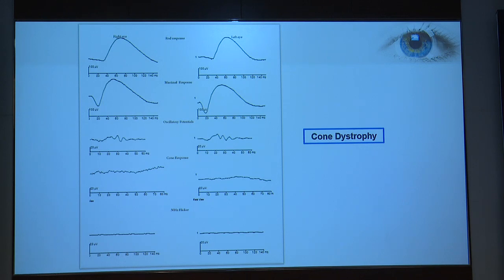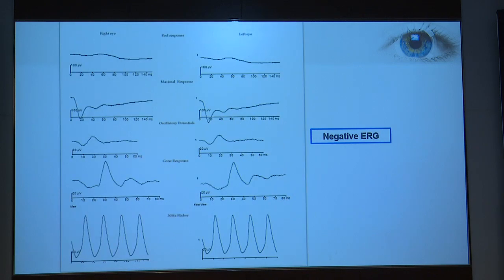We can talk to Dr. Subhada Jalali and ask her for opinions. There is something like negative ERG also, in which the B wave is a little lower than the A wave. They happen in certain conditions. It's there in your handouts. You can go through it.